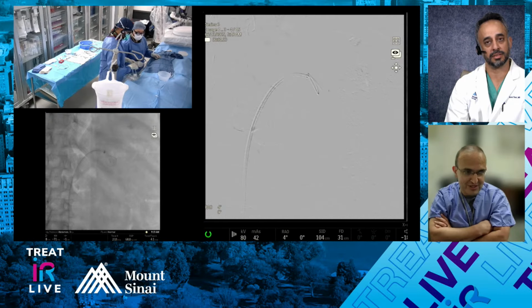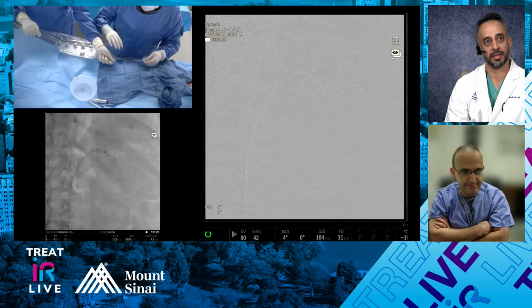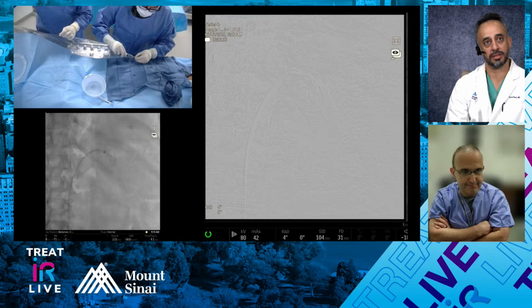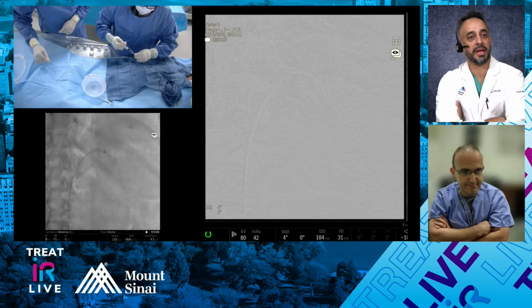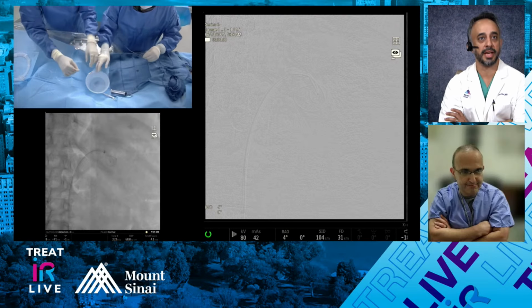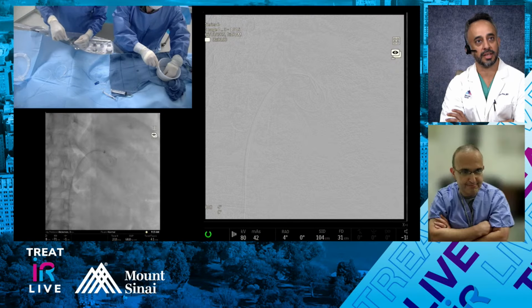Thoughts, both of you, with that kind of size: are we talking fibered or non-fibered? Is there a difference? How does it feel, either of them? It depends on what you prescribe to. In terms of data for aneurysms, most of it is from neuro, and in terms of durability, they're unfibered coils and looking at packing density.